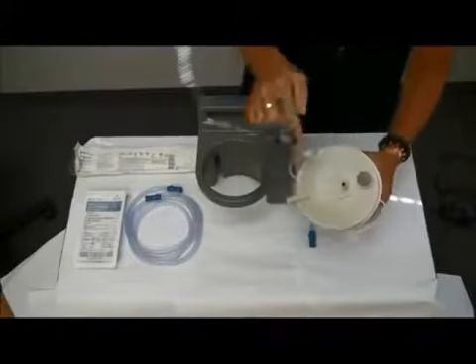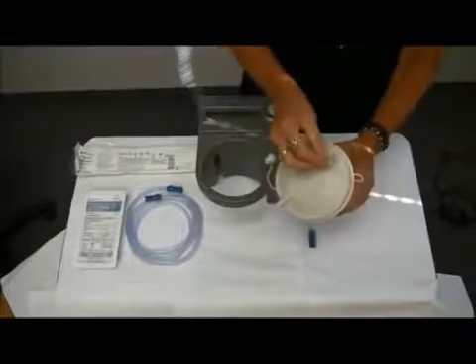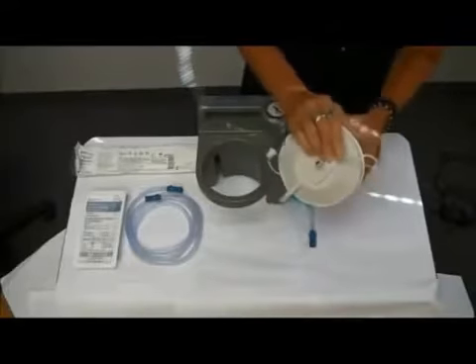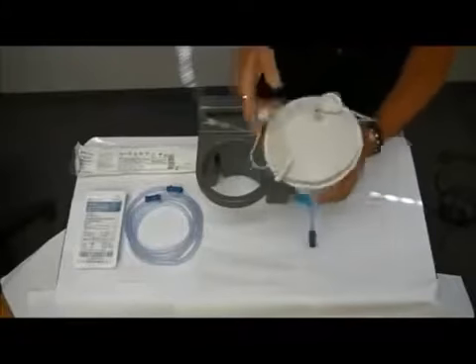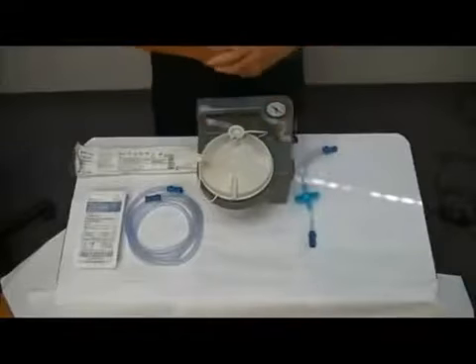There are also two openings on the top of the canister. The large opening has a cap, and you want to make sure that that's closed. Your canister will fit right into your suction machine, like so.